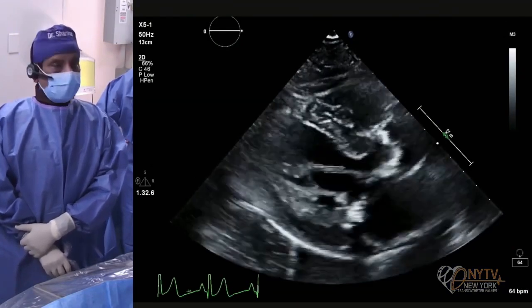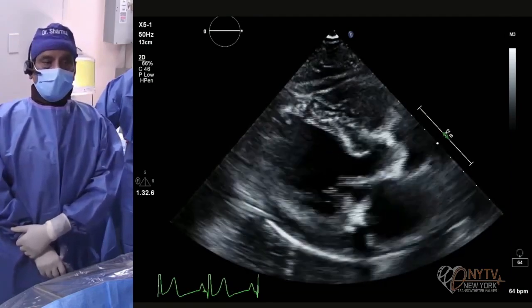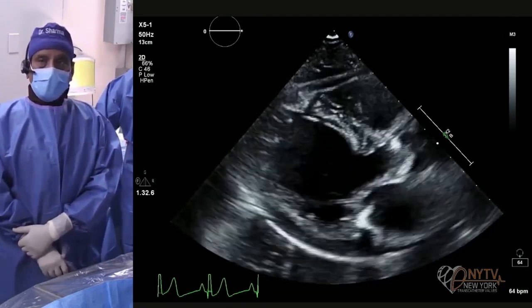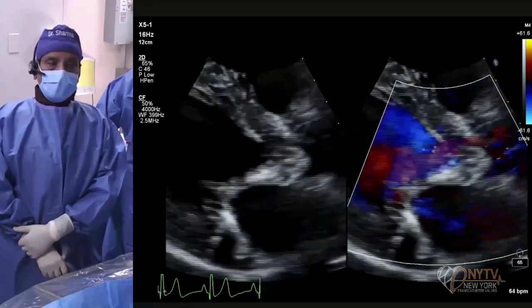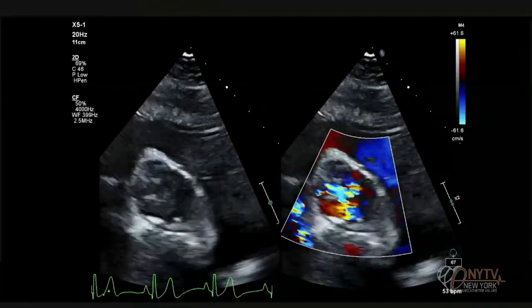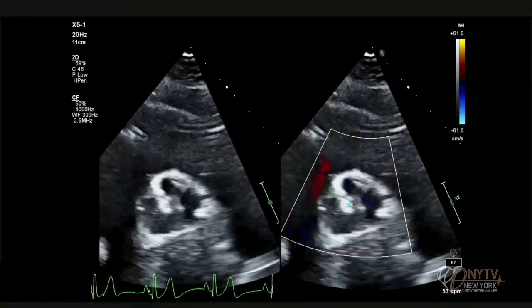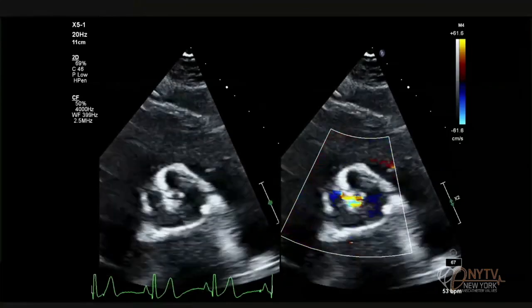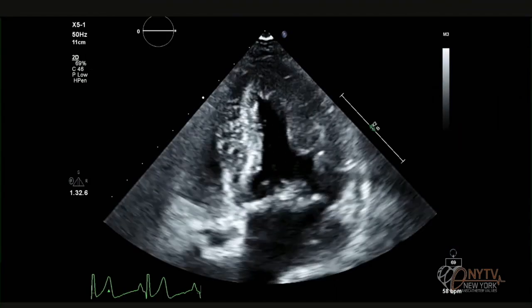In our parasternal view here, you can see mild LV hypertrophy and moderate aortic insufficiency on color Doppler. You can see there's very minimal tricuspid regurgitation. And then very lovely here is our quadricuspid valve. You can see that beautiful cross sign, and then the central aortic insufficiency. On freeze frame here, you can see that beautiful cross for the quadricuspid valve.